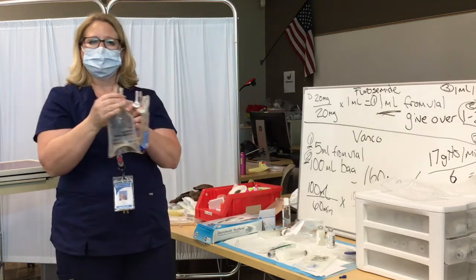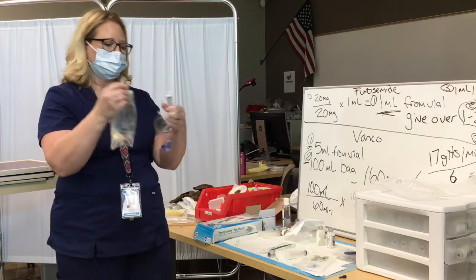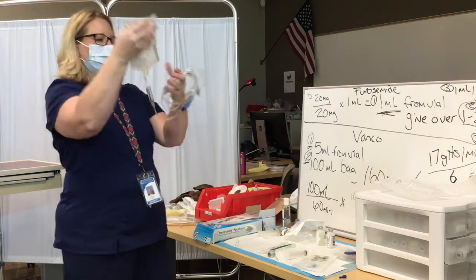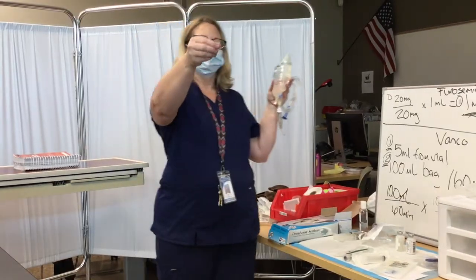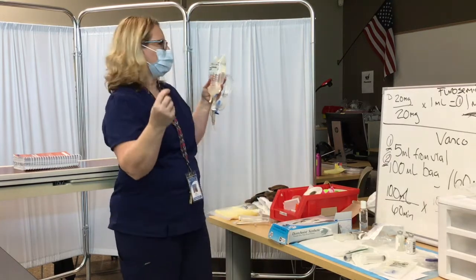And one of the block 2 skills was spiking and priming your primary line. So this should be a block 2 skill that we're redoing. We're going to cleanly spike our thing. Now, at home, you don't have an IV pole. Hey, I don't have an IV pole in my med room. I have a paper clip. I think you have a paper clip.